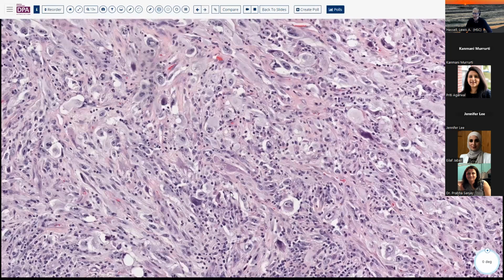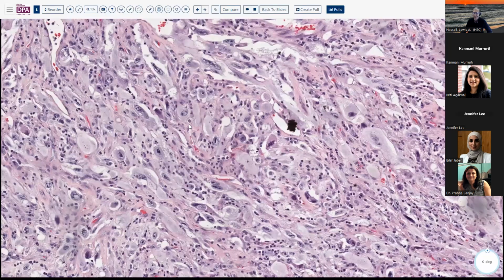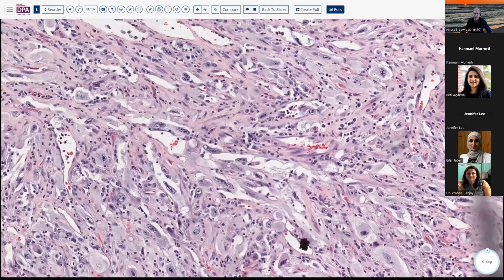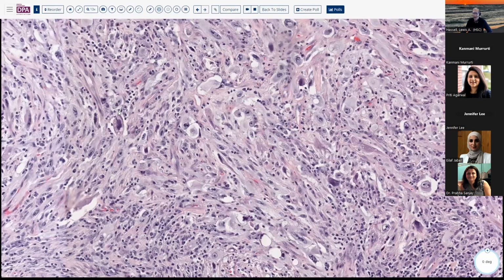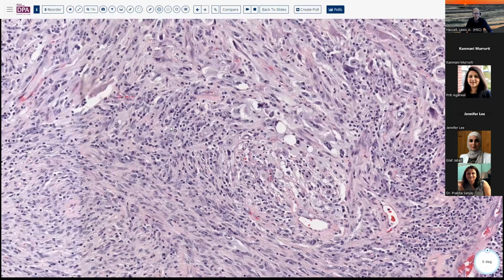It has these bizarre high-grade, highly pleomorphic cells, and that's usually indicative of a very complex cytogenetic, molecular genetic backdrop or milieu, where these cells tend to have a very complex karyotype and not have any specific predominant mutational changes that would allow us to subcategorize them into the category of a more specific tumor like myxofibrosarcoma or solitary fibrous tumor with the STAT6 fusion mutation.